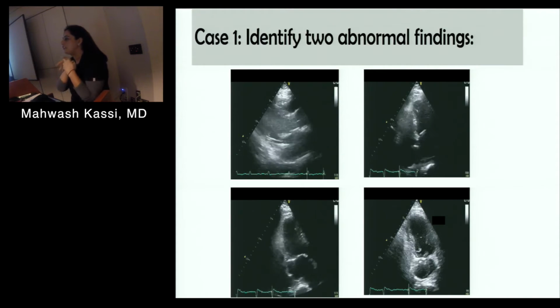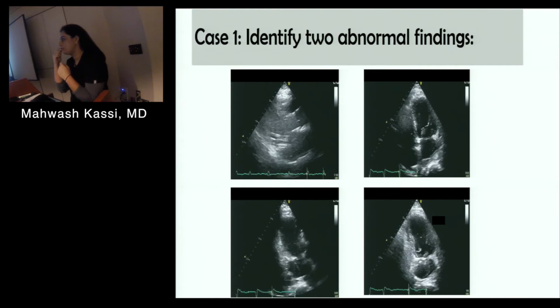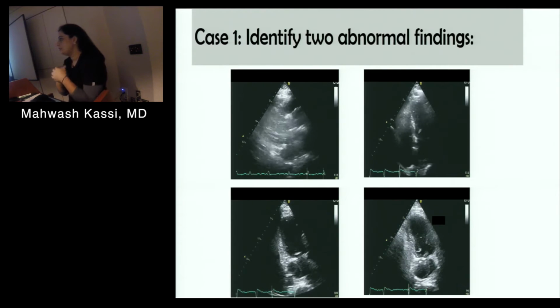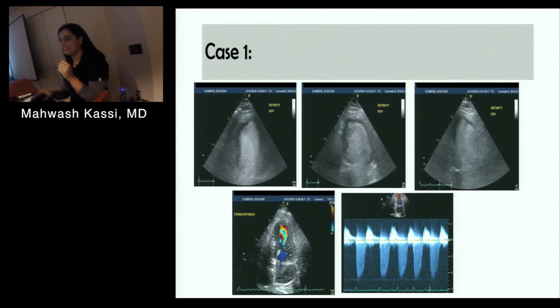Any of the sonographers want to take what this would be? Anyone if you've seen this? So I guess we have no takers on what that is. I guess the question is what would you do to further evaluate that? They want some more pictures. This is what I got. It was a really nasty echo.